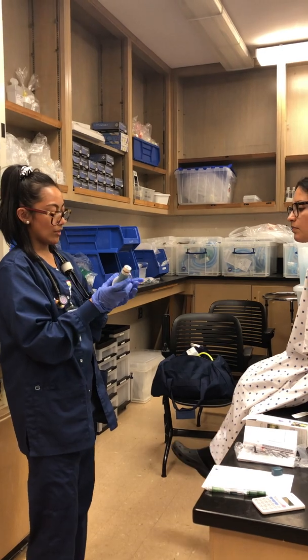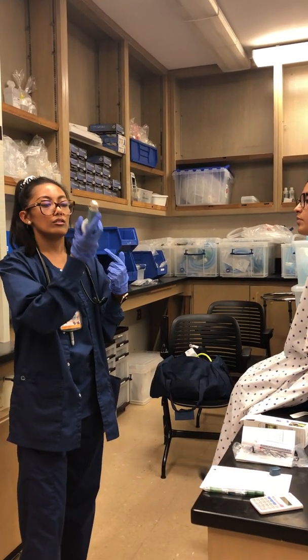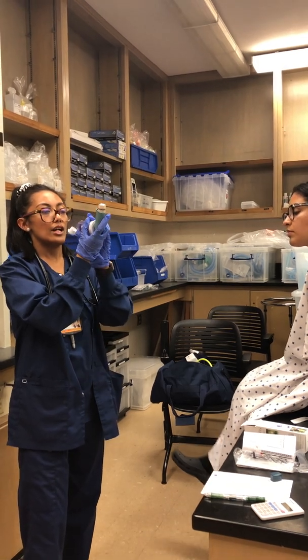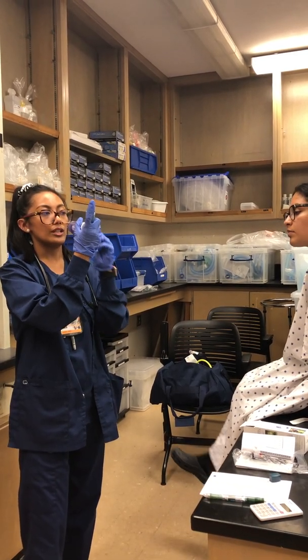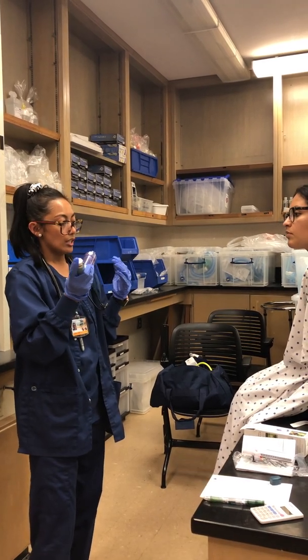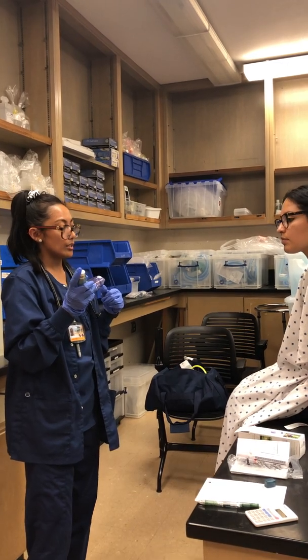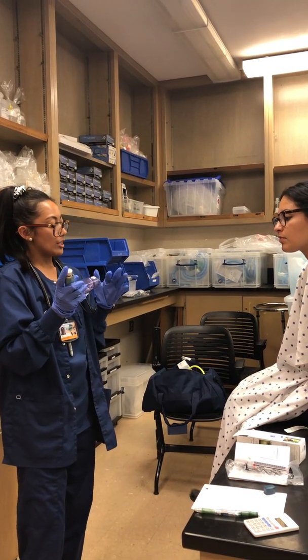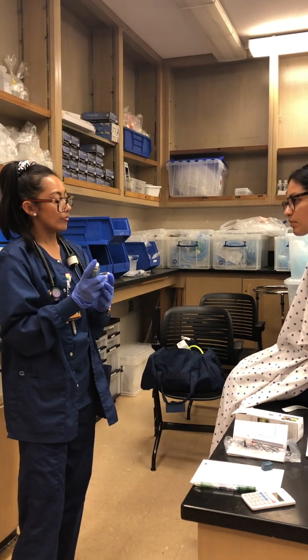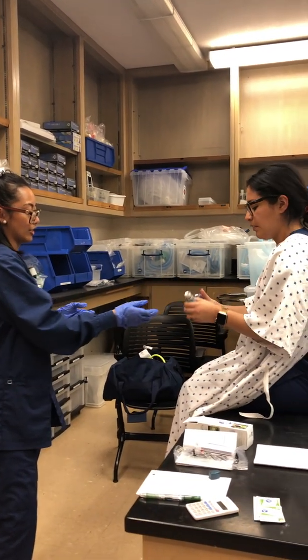Fits like a glove, and then we would tilt our head back like this, hold the spacer up to our mouths, and then coordinate the press with the inhale in. That is slow but deep and smooth. And we want to hold that inhale for at least 4 to 10 seconds, 10 being the best. And then when we want to exhale, we'll exhale through our nose. You think you should show me? Yeah. Okay, sounds good. I know it's a lot of information.